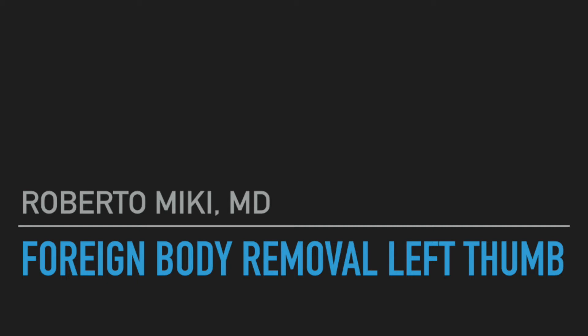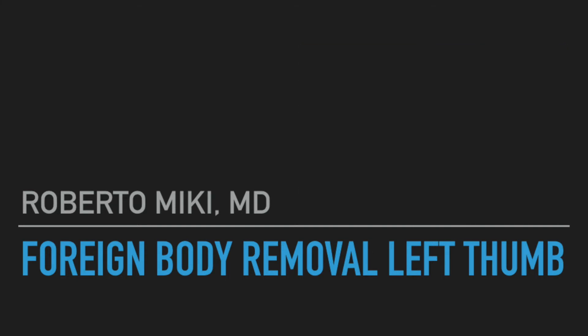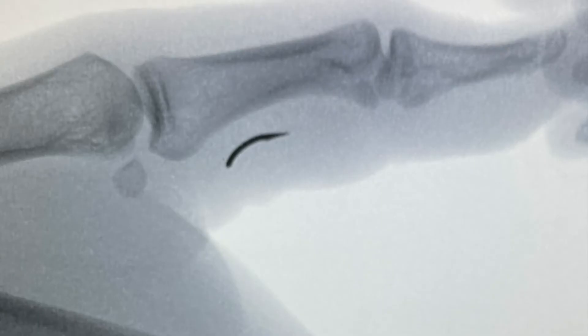Hi, it's Roberto Makey and we have a short video on a left thumb which had a hook stuck in it. A fisherman got a hook stuck in him and he couldn't get it out, so he went to the emergency room. They ended up cutting the hook so they could grasp it, and in doing so they released the foreign body, but it ended up retracting under the skin because it was actually stuck in the tendon.